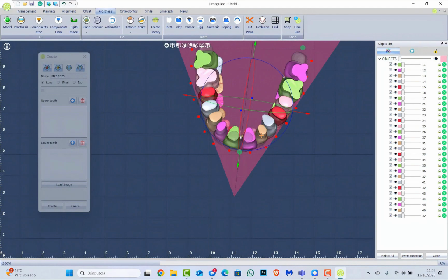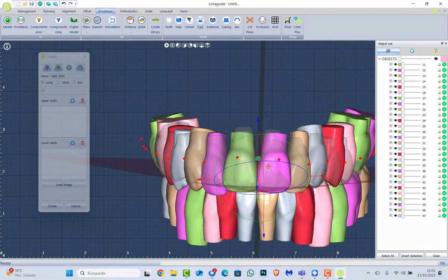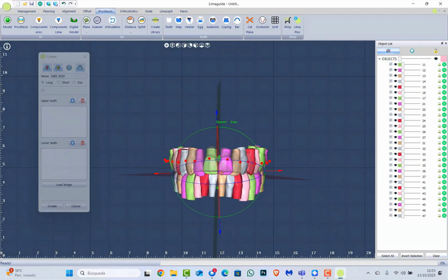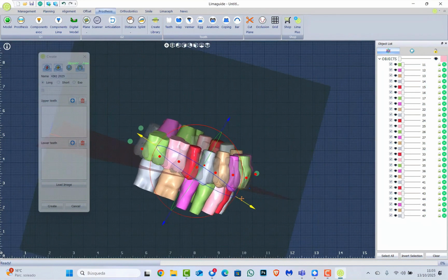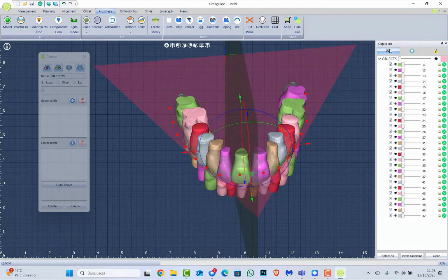So the important thing here is not to make them exactly fit, rather for them to be centered and to have them properly aligned with the horizontal and the vertical plane. Remember to also press Ctrl while doing these rotations. I'm going to leave it like this. Now that I'm finished, I don't need this button anymore.